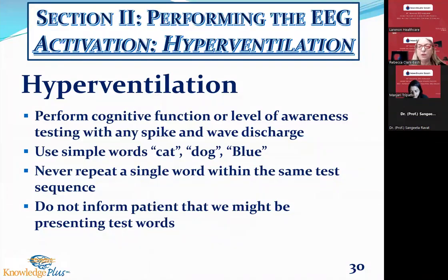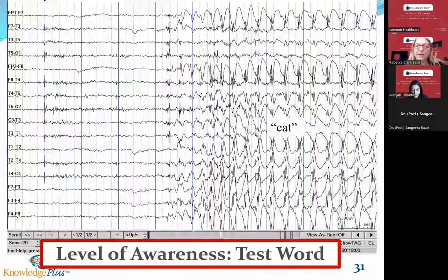I don't repeat a single word within the same test sequence, meaning I don't say cat, cat, cat, because they might catch it coming out of an episode. So I try to use a new word for each episode. And I don't inform the patient that we might be presenting test words. So I don't say, I might say cat, I might say dog, I might say blue. I say a word unexpected that makes no sense to the patient. So they go, well, yeah, you said cat. And again, I can't stress enough, all of that is documented for the reader.